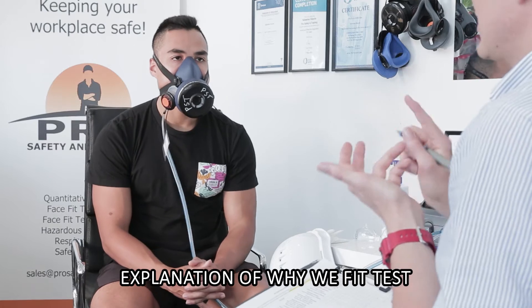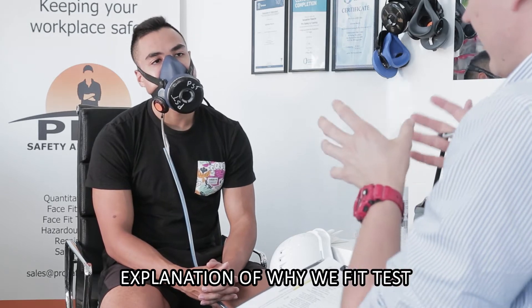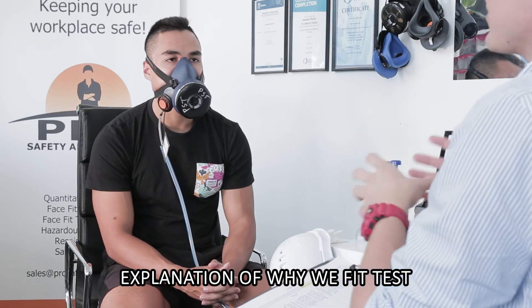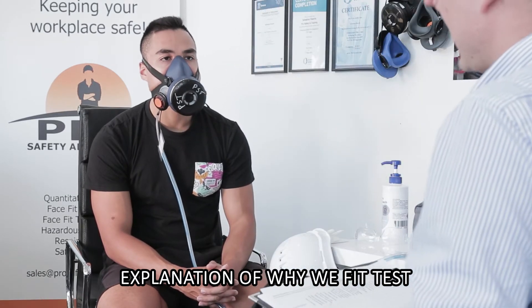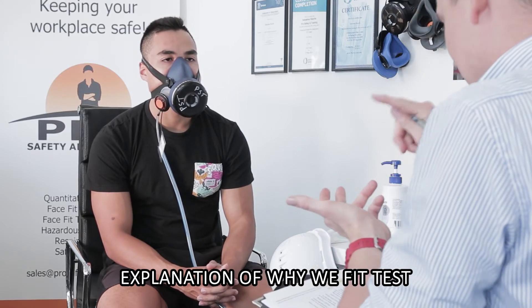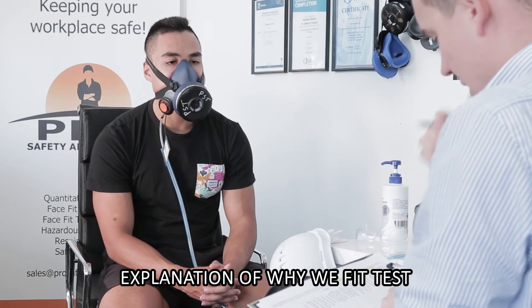James, what we're doing here today is a fit test — we're checking two things: that it seals on your face, and that you can put the mask on. We're trying to find the respirator with the best fit on your face. Please note, although it may fit really well, if it's not used in accordance with standard AS/NZS 1715 and the manufacturer's specifications, it's not going to be suitable for that environment. With that respirator and filter, you can only use it for particles where you need a protection factor of up to 10. You're not going to be able to use it for gases, chemicals, low oxygen, or underwater. You can only use it for particulates in certain environments.